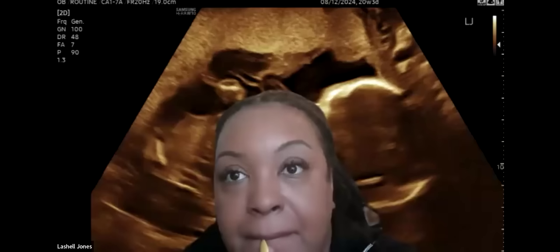On the ultrasound scan, for instance, you are measuring NT, and it's obvious the NT is above the normal range, which is an indication of an anomaly, but the blood came back with low risk. So what structures are you looking out for to further follow up in terms of the baby?